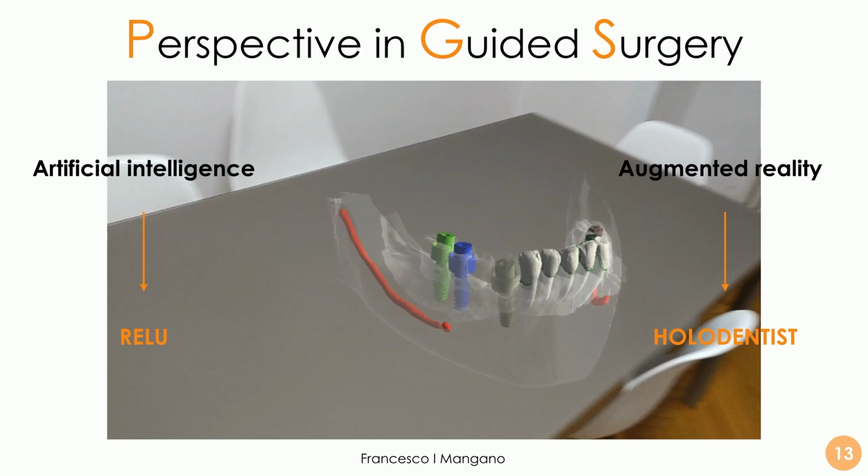So it is an idea we are developing, and we are preparing a publication because we made some cases. Obviously it is necessary now to check everything, going back and saving back all the positions in a computer-assisted design software like Mimix or any other software.